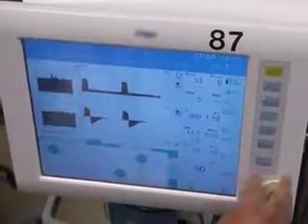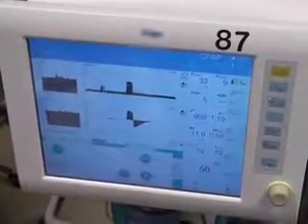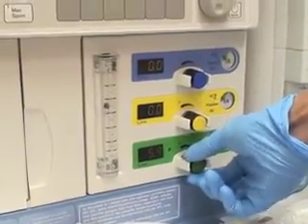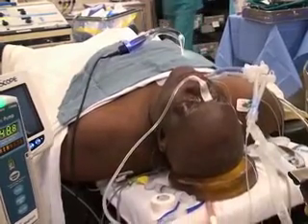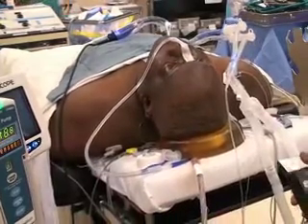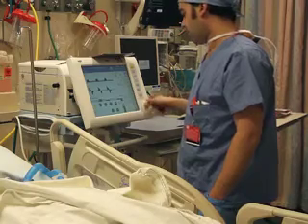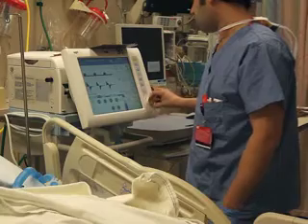In preparation for extubation, adjust the ventilator to ensure that adequate respiratory effort is present with minimal support. Oxygenation should be maximized with 100% inspired oxygen delivered through the breathing circuit. Place the patient in a semi-recumbent position to reduce his or her work of breathing and improve oxygenation. An upright position increases functional residual capacity, allowing for longer periods of apnea before oxygen desaturation occurs. Make sure that the tidal volume, respiratory rate, and inspiratory force are at appropriate levels before beginning extubation.